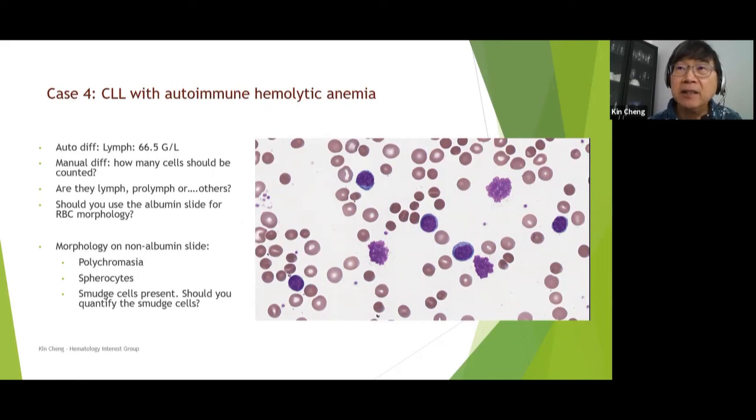At one time, there was one CLL patient where the doctor actually came back to ask us, does the patient actually have neutrophils? You have reported 100% lymphocyte, and I want to know whether the patient has neutrophils, right? So you must scan the slide. If you see neutrophils, report occasional.